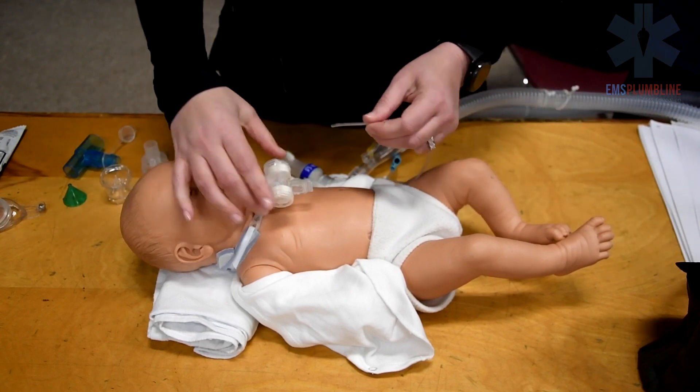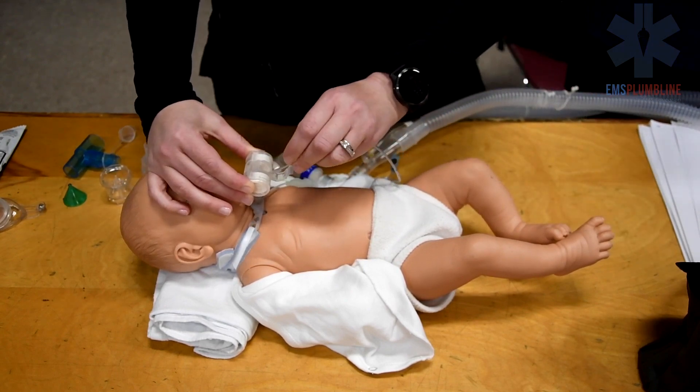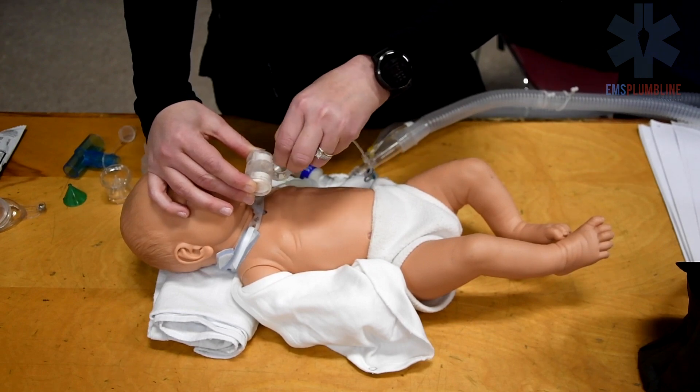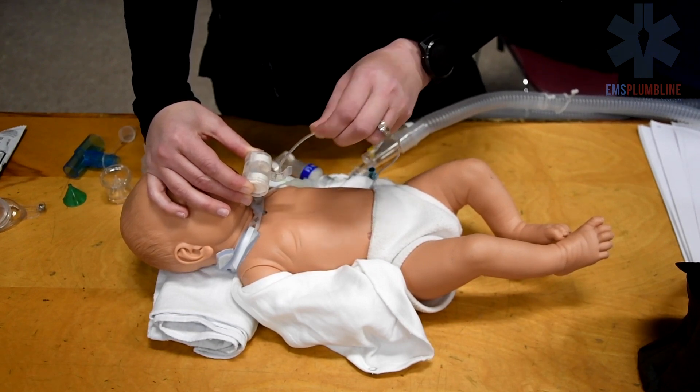See how we can insert the suction catheter through the end of the HME to perform suctioning without removing the HME.